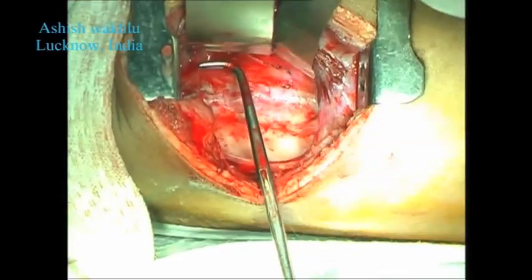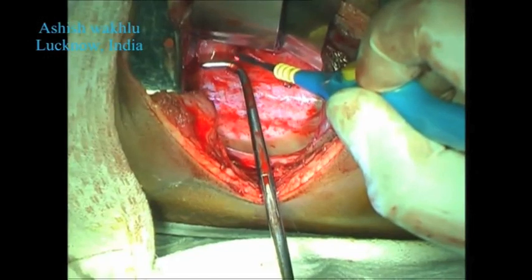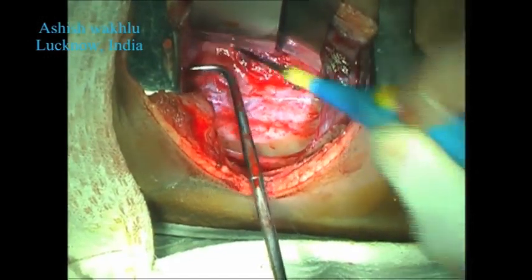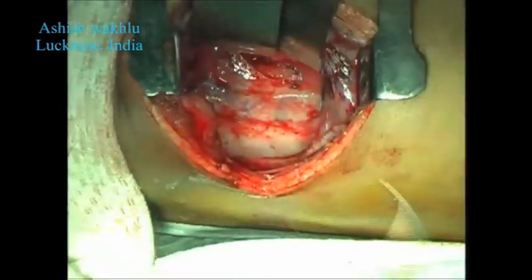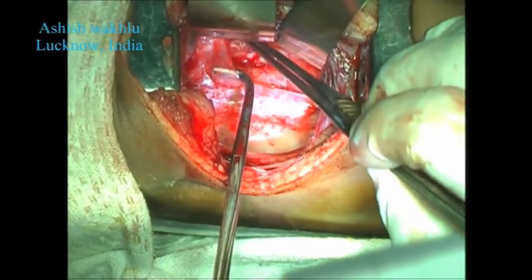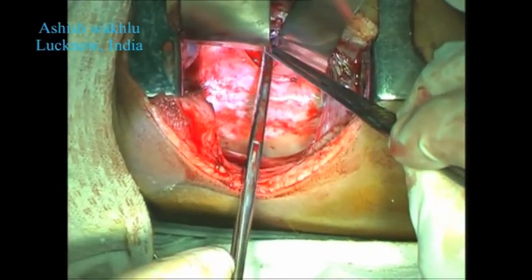We continue to dissect the mediastinal pleura on the right side to try and identify the hilum of the lung and the tracheal bifurcation. The pulsations of the aorta can be clearly seen, and the vagus nerve is about to come into view.